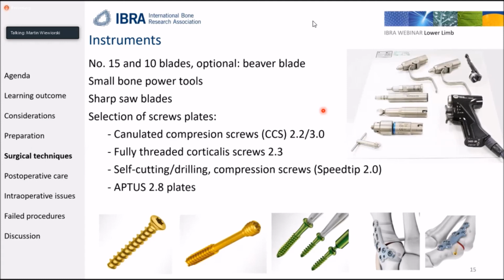Just make sure you have really sharp saw blades, because you don't want old, dull blades. When you do the osteotomies you need sharp blades, because if not, you're going to force it and create some false planes, and this will basically affect the outcome of your surgery.